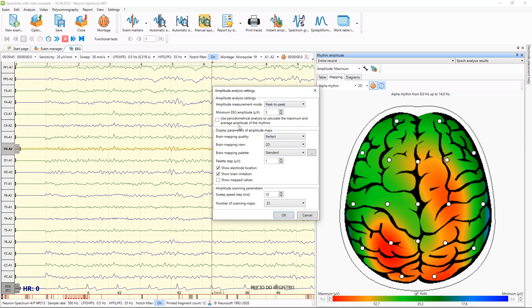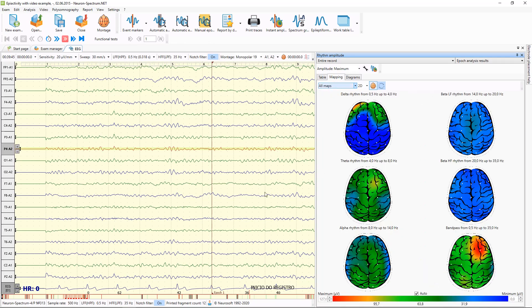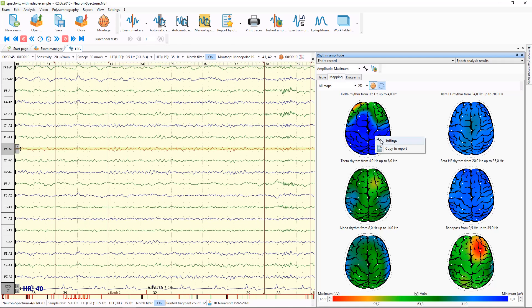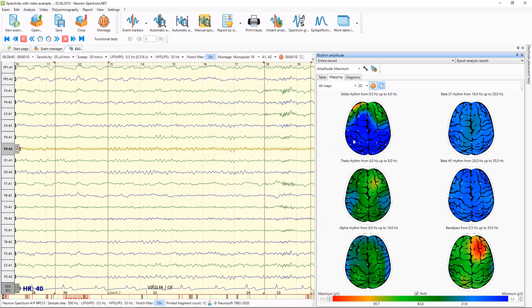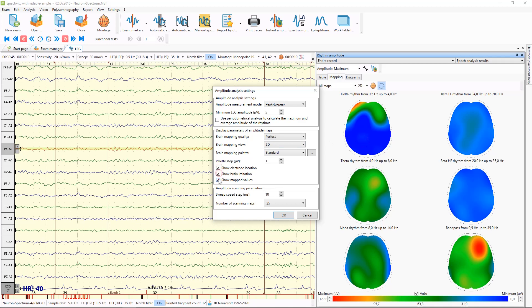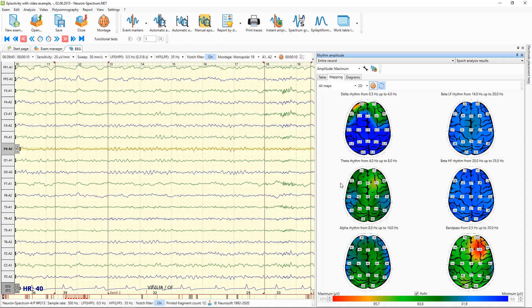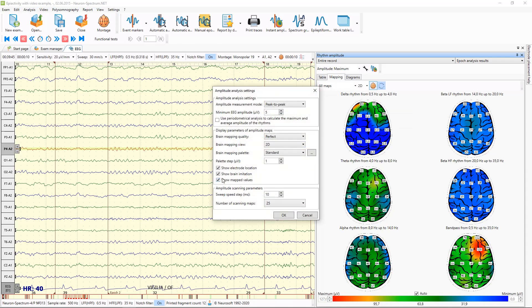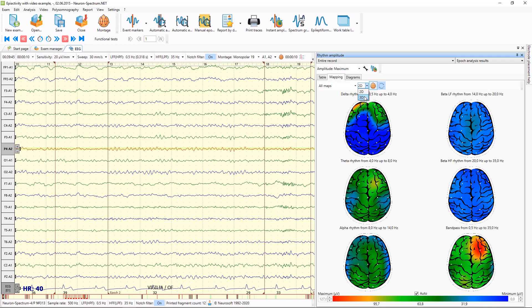Also, in Settings you can set up some parameters of mapping — for example, increase the quality of maps, or make electrodes visible or hide them, or make the mapped values visible on the maps. You can also use 3D maps.